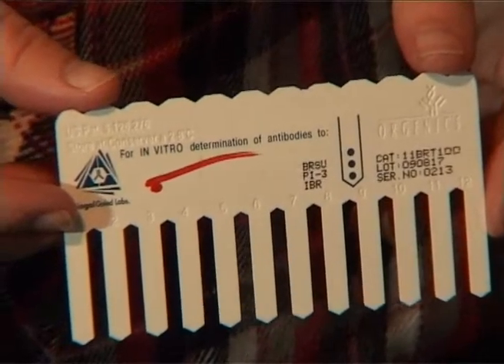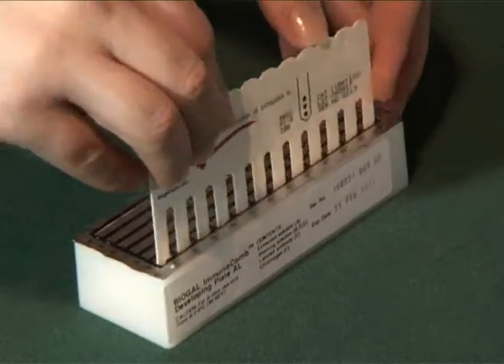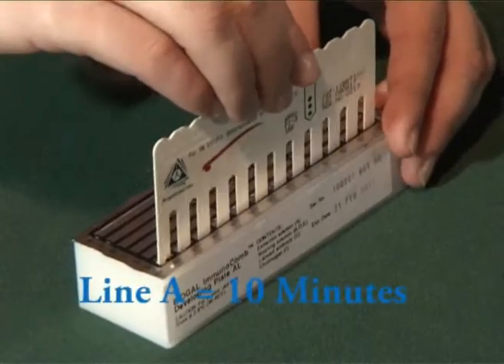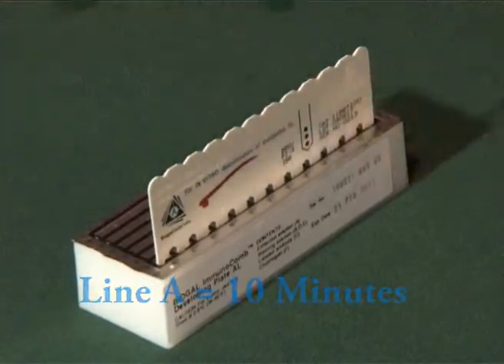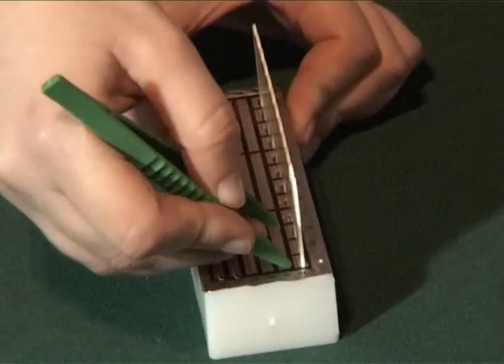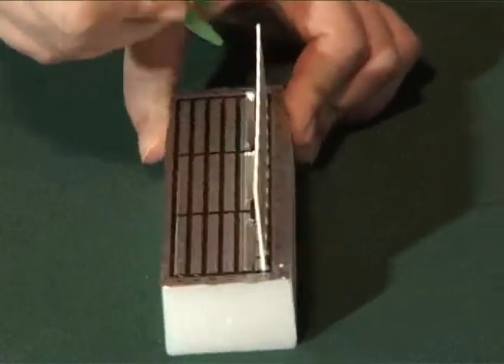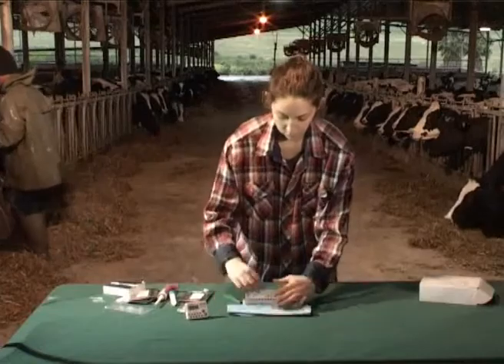Insert the comb in line A and develop for the time stated in the instructions. During the process, gently move the comb up and down. Then punch line B, remove the comb from line A, and remove the excess liquid using a piece of paper.